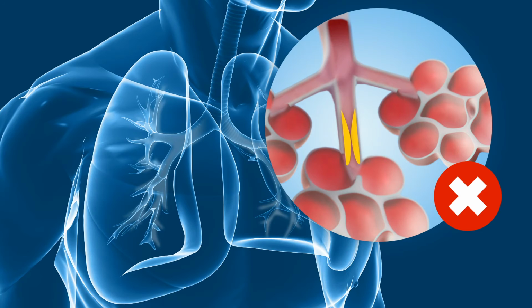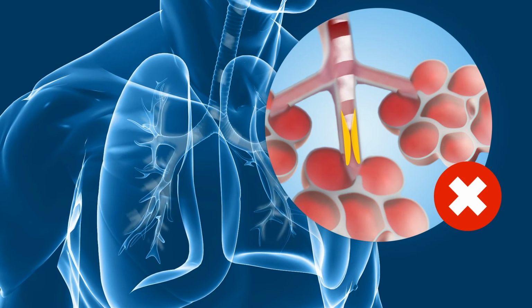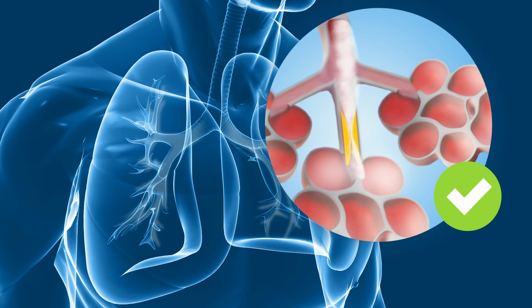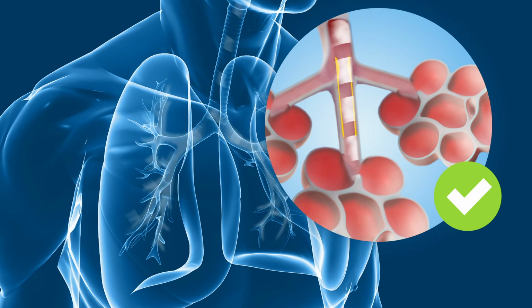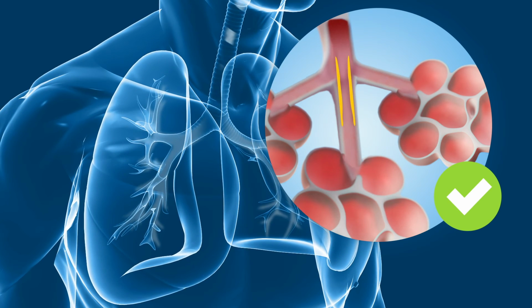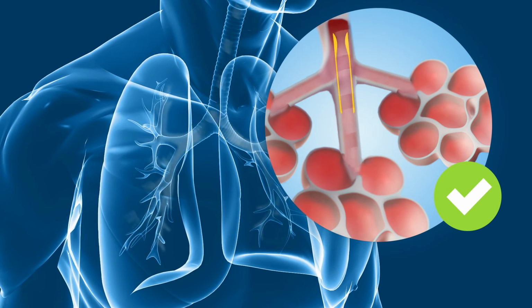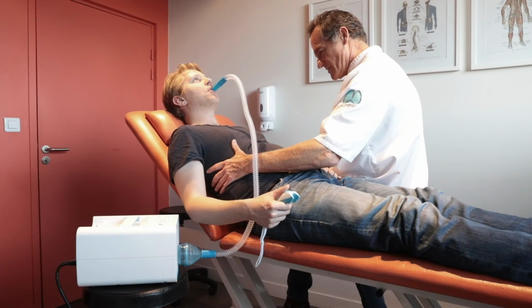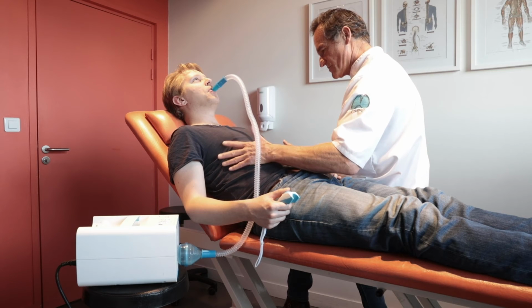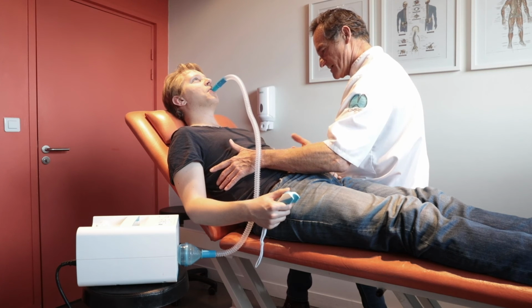Any area not supplied with air will not benefit from the action of the Simiox technology. The inspiration must allow homogenization of the ventilation necessary to transport air behind the secretions. The Simiox action is based on a transfer of energy between air and mucus. The physiotherapist scrupulously accompanies this step and teaches the patient how to inspire correctly.